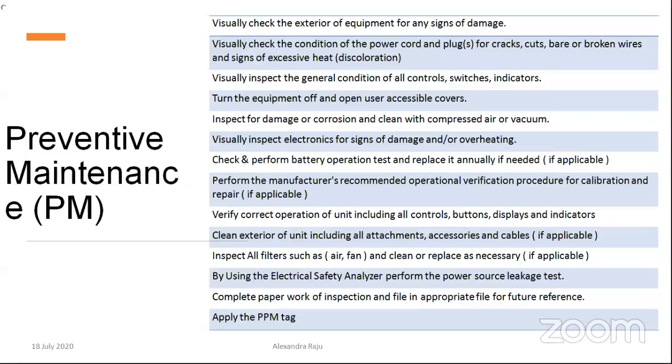for example, in patient warmers. And for the ultrasound equipment, there are filters which will easily be affected by dust. So once the filters are fully covered with dust, if you are not removing that, the ultrasound machine won't turn on. It will not function. The same goes for a patient warmer, it will not perform if you're not cleaning its filter. In order to ensure air circulation, we are using these kinds of filters.